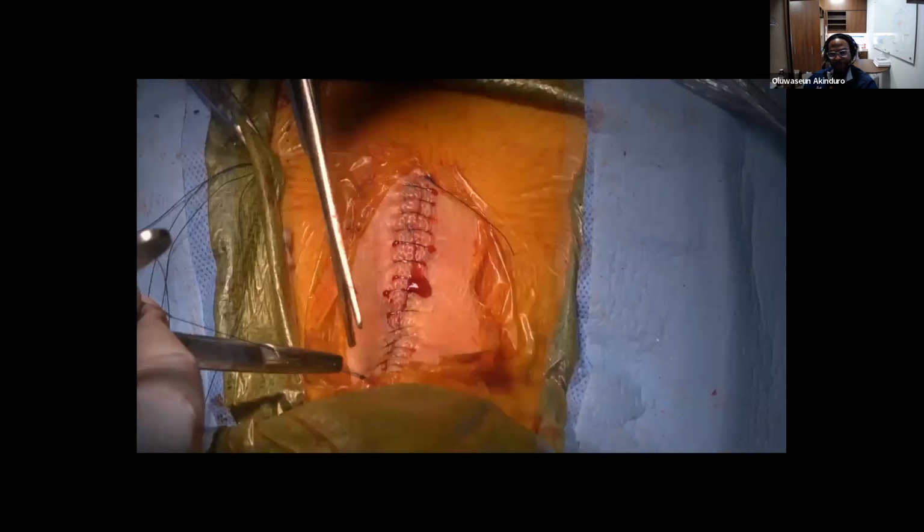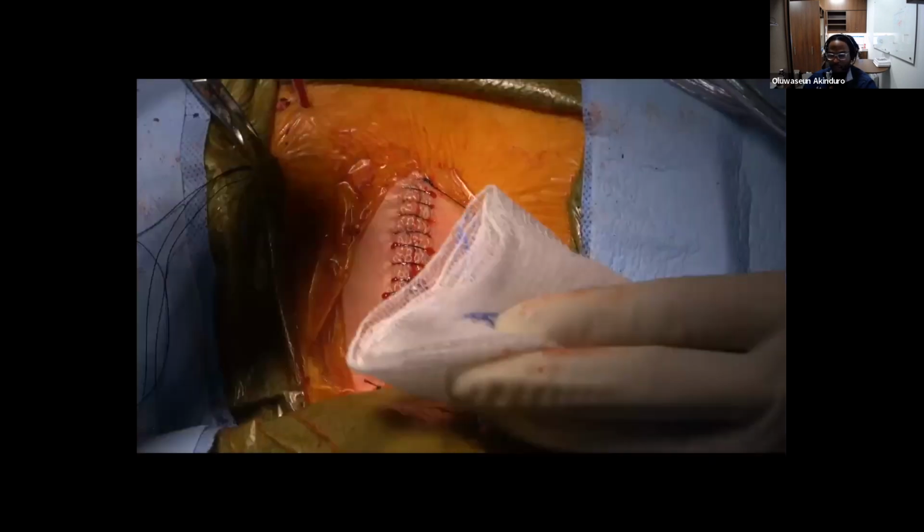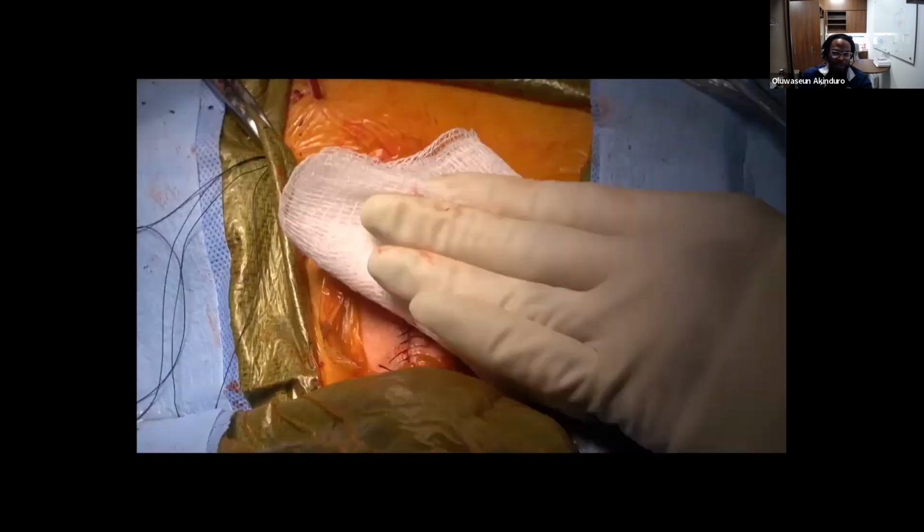So if you don't do that and then lay some bone graft, we mostly just used her own bone that we got from the laminectomy. We stuffed it into the facet joints, and then out over the lateral masses just to form a fusion mass. And then for intradural work, we typically close the skin with a running suture, non-absorbable.